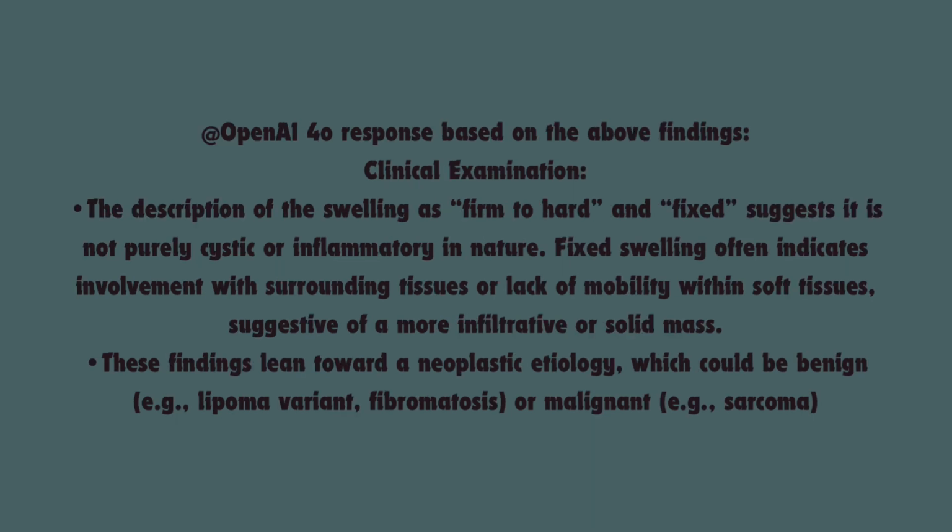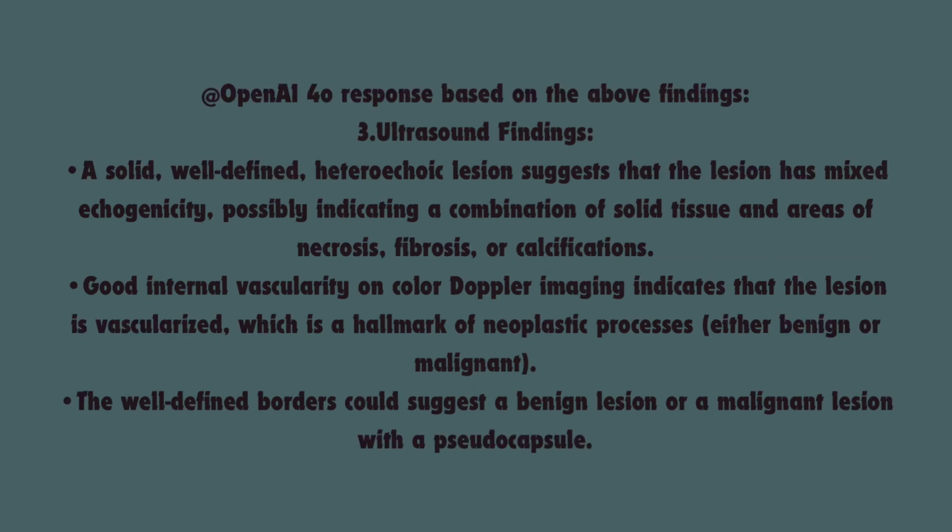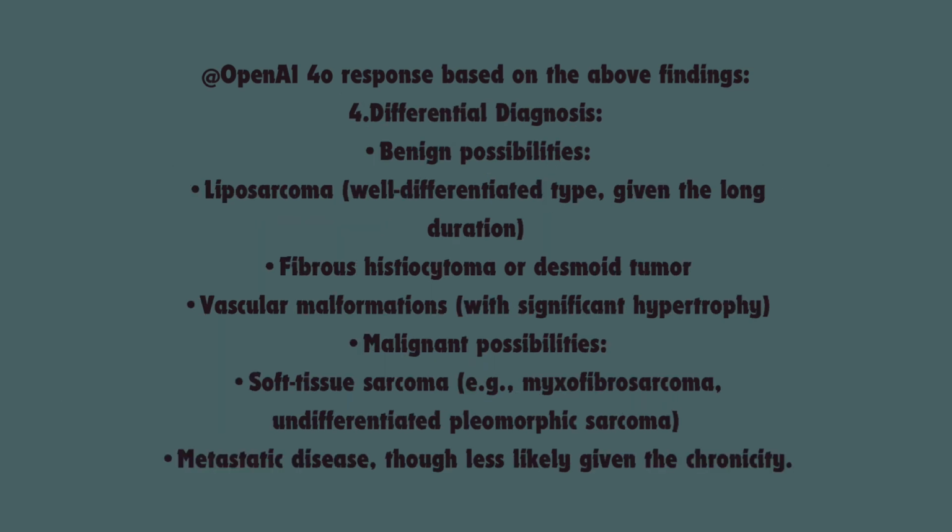Well, they started by feeding the AI the clinical notes and the ultrasound results. So the AI had some background. Exactly. And then they gave it the MRI images. But here's the thing, they gave the images one at a time. Oh, so sequence by sequence. Yeah, it was wild because the AI would give an initial assessment after each sequence. So it was building towards a diagnosis.